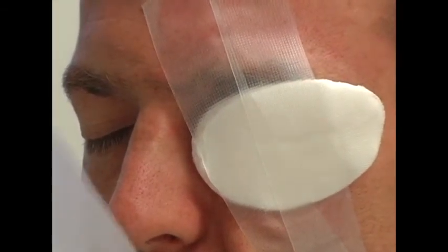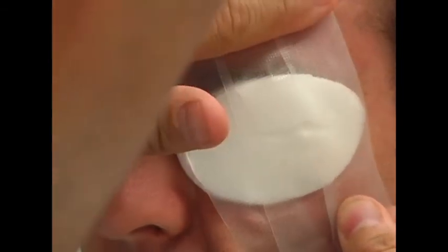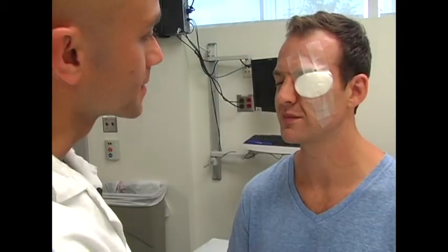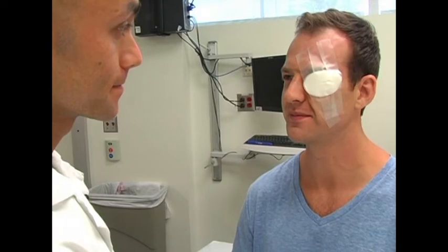If the patient has a significant amount of facial hair, the tape may not stick. An elastic strapped pressure patch may be applied instead. Open your eyes. Does that eye stay closed? Yes. If the patch is properly placed and taped, the lid under the patch will remain closed. If the patient says his or her lid can open, remove the patch and try again.